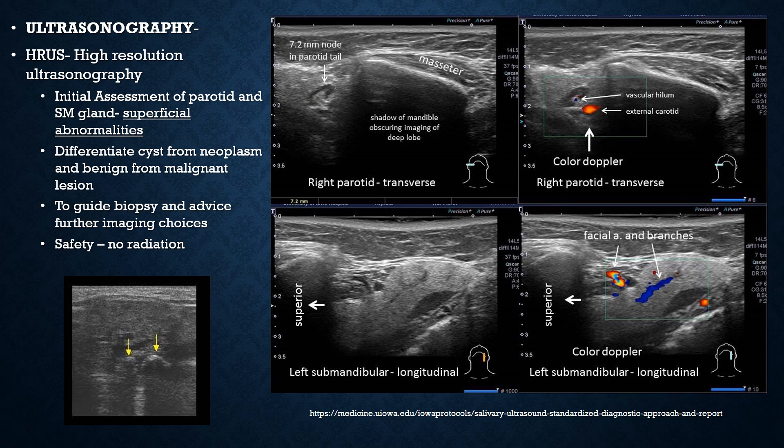The advantages of ultrasonography include safety as it involves no radiation. The salivary glands are easily accessible, and any calcification within the gland can be detected, as well as details of anomalies and neoplasms. This example shows how the parotid appears on ultrasonography with color Doppler applied, giving a clear view of the facial artery and its branches, the submandibular gland, and the parotid.